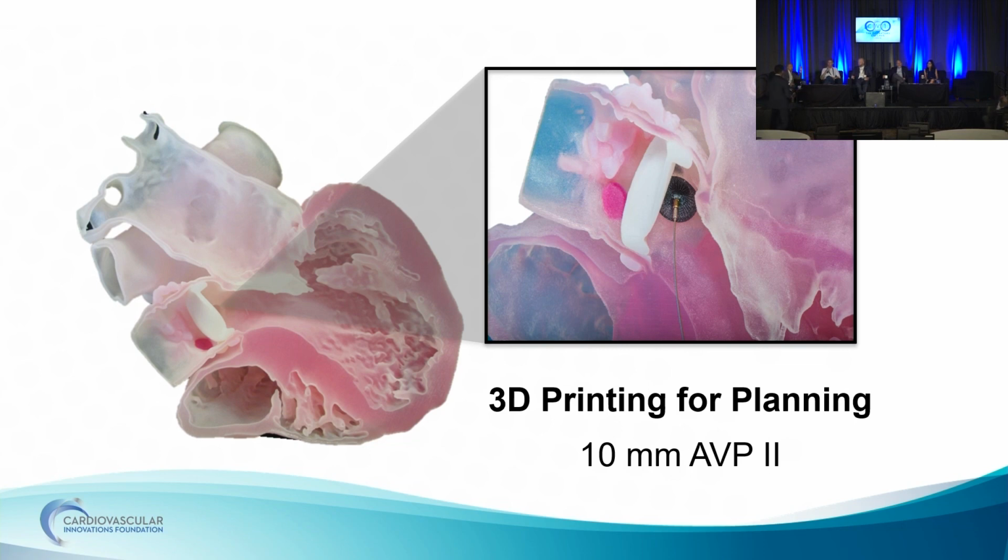Is this your center that does this, Mayo does this, has their own service? Yeah. So our radiology group has gotten really good with it, and it's gone through various different forms. Like I mentioned, a more hard plastic type material. This is one of our newer type models. But yes, we use our CT, and our 3D lab does a great job in terms of printing this for us. Yeah.